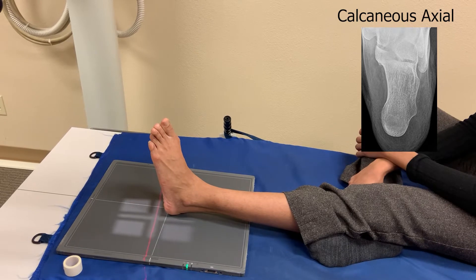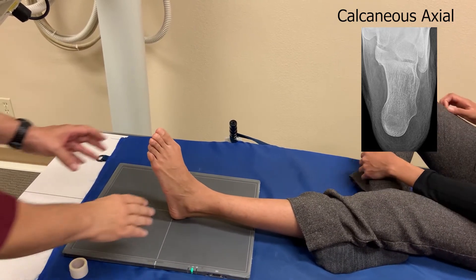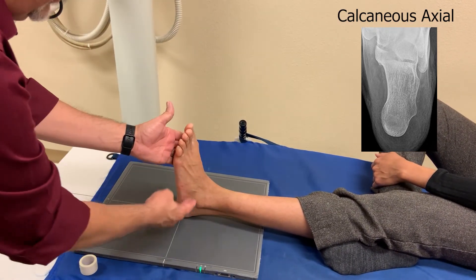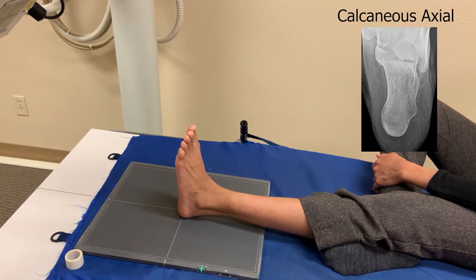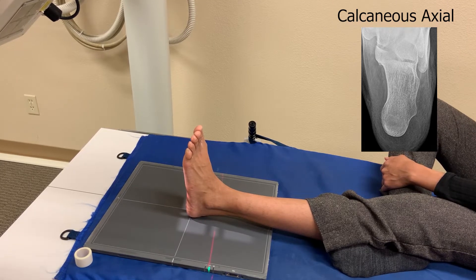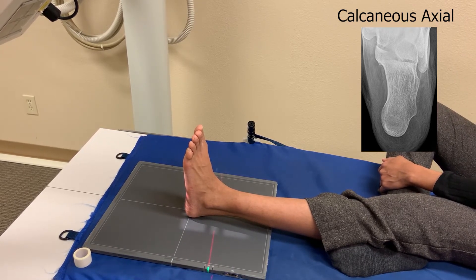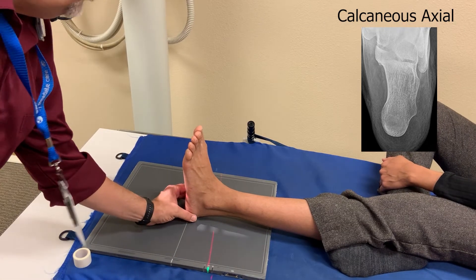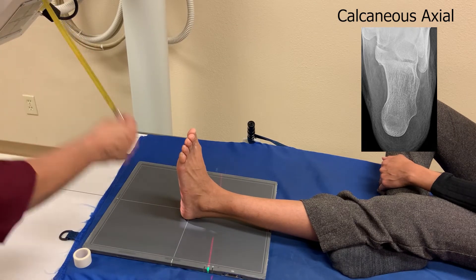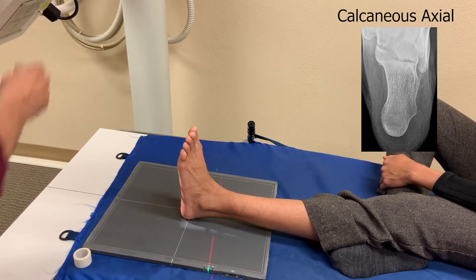So we're angled at 40 degrees. Now the difficult part is, much of the time somebody can't pull their foot up very well. Now Nikki's pretty capable, so she can bend her foot up. So you want a nice 90 degree angle, and you want to center mid shaft or mid body of the calcaneus. And shoot your film. Make sure you maintain that 40 inch distance — when you angle that much it can be kind of hard to tell. And we are at 39 inches, so that's pretty close.